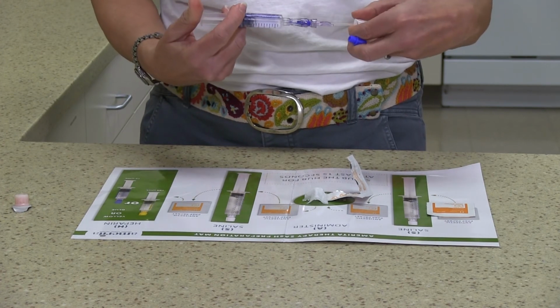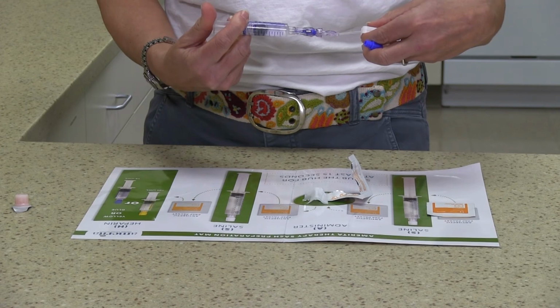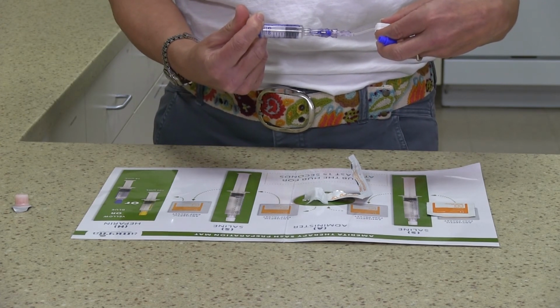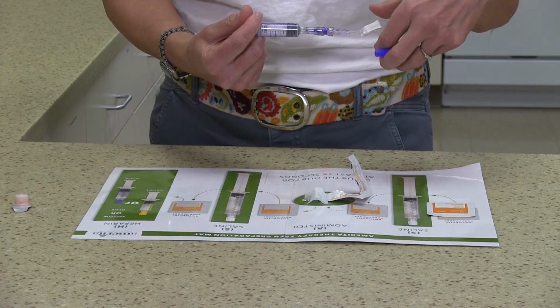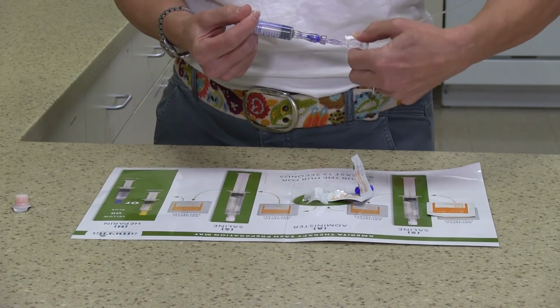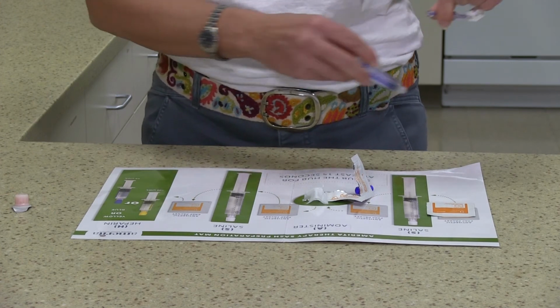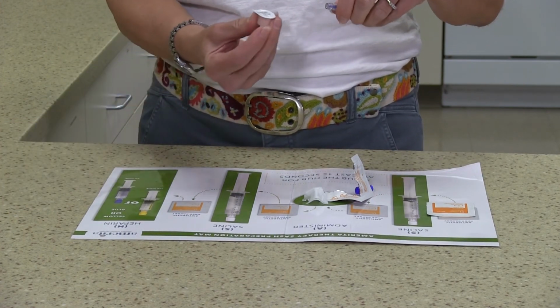If you used the pulse method when flushing with saline, we recommend that you do not use this method with the heparin and just slowly push the prescribed amount of heparin into your IV catheter. Then clamp your IV catheter before removing this heparin syringe, and then throw the syringe away. You can now put on a new swab cap on the end of your injection cap.